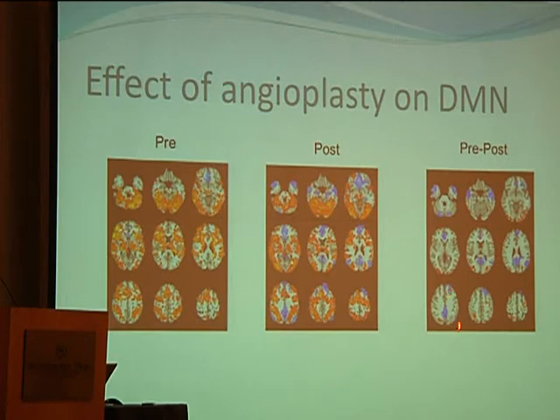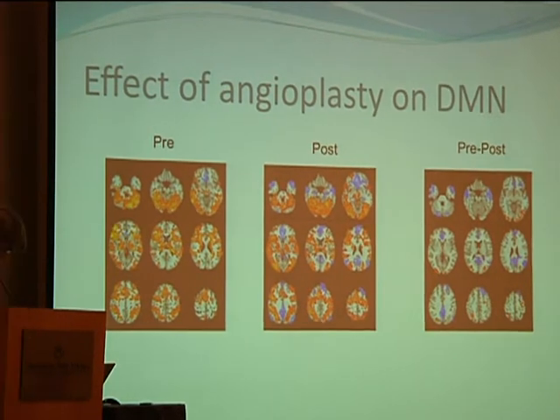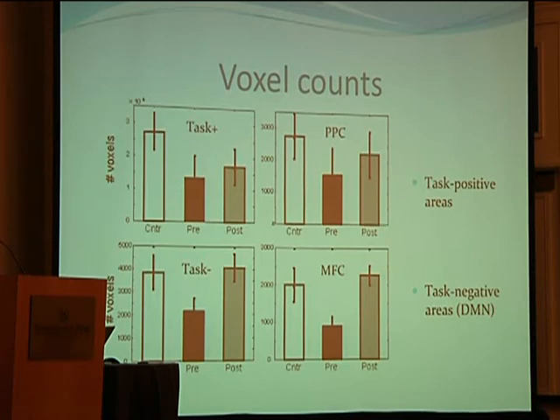What the difference shows is that, first, we can again see the default mode network, but also there is a little bit of reddish voxels, which means that overall the activation in cortex seems to increase. And then if we look more quantitatively at individual cases, we can use voxel count as a measure of overall activation. So let's focus on this for a moment.